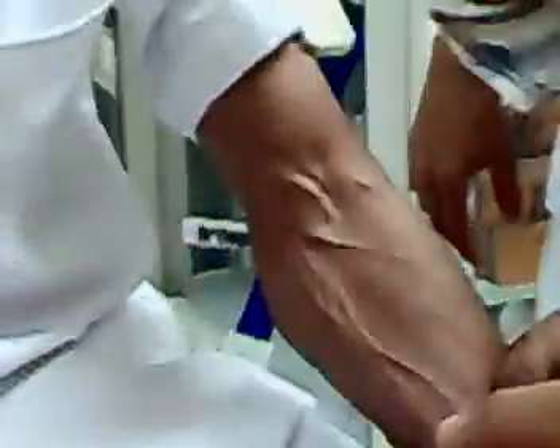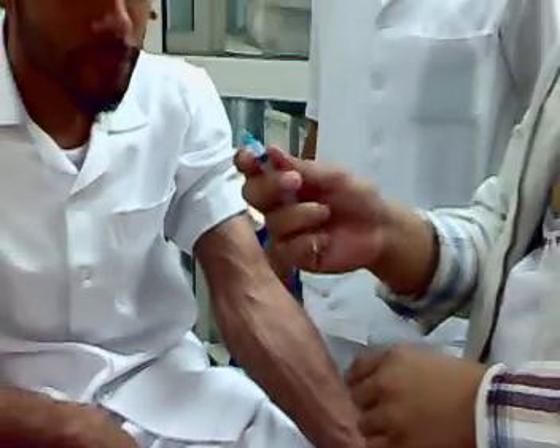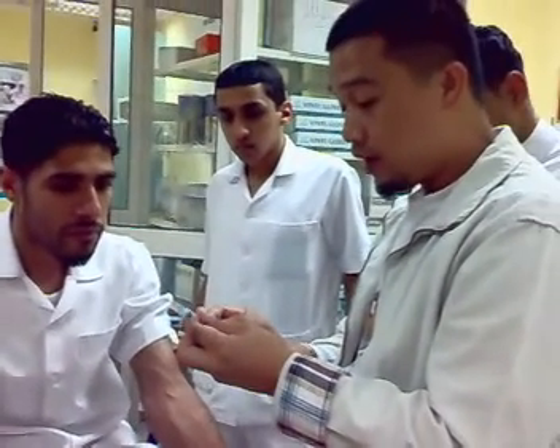When you use the syringe, you have to twist it to make sure that the needle is intact, because sometimes it can be loose. Also, you have to check the air — sometimes the plunger has some problem and it is very difficult to pull. So make sure it is okay.